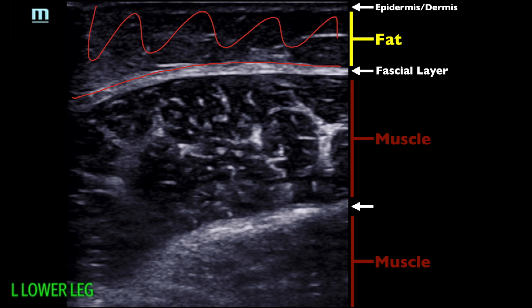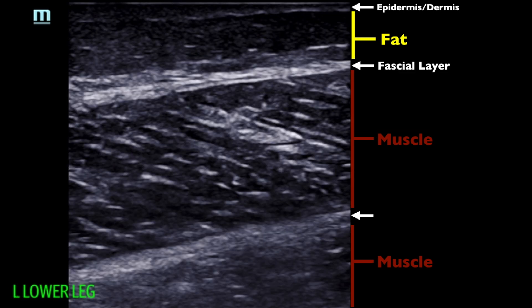Whereas if we're down in this area below the fascial plane, coursing between muscles — not in the muscle but between muscles — that's going to be a deep vein and the treatment's a little bit different for that. This is just a long axis view of the same area showing once again our fascial plane right here.